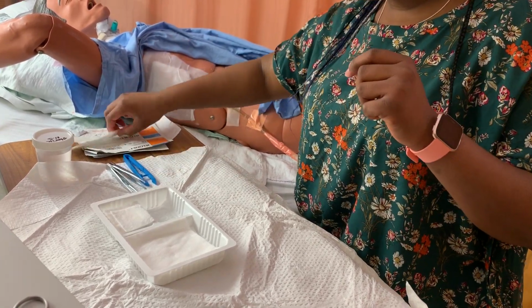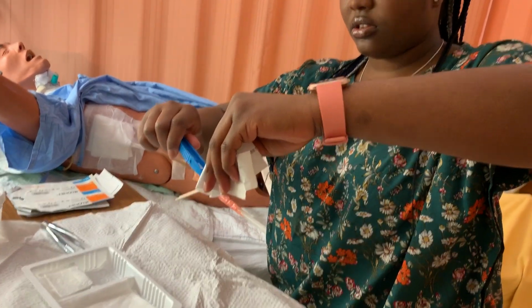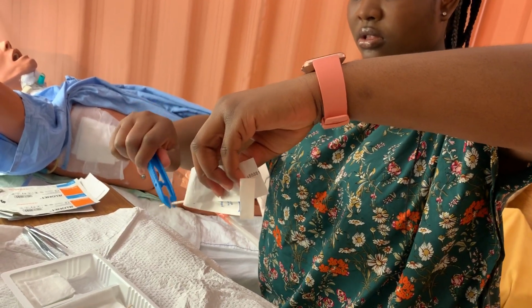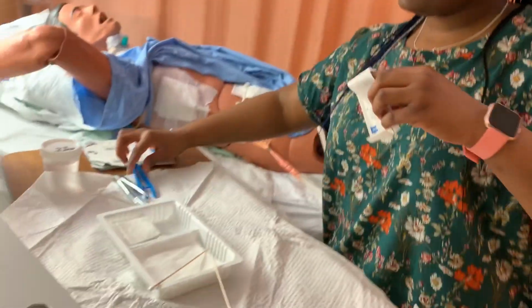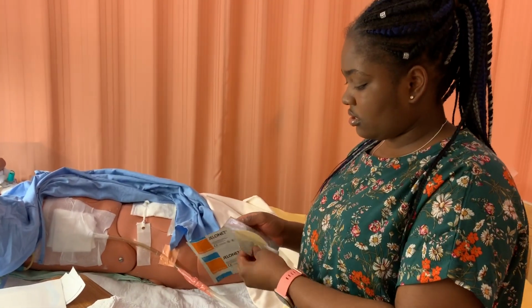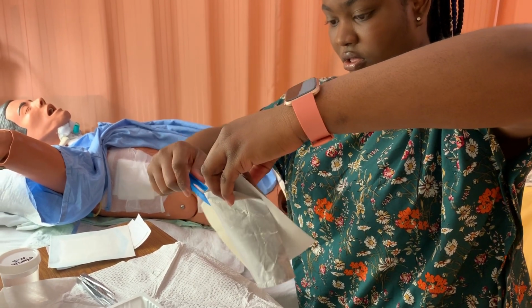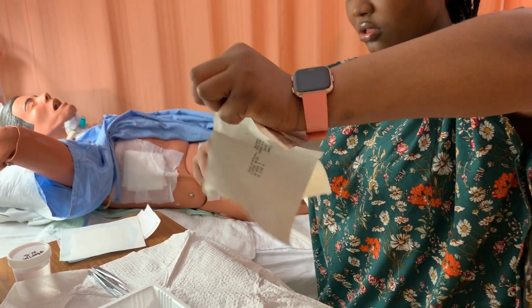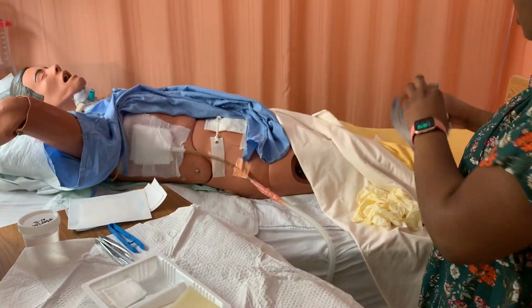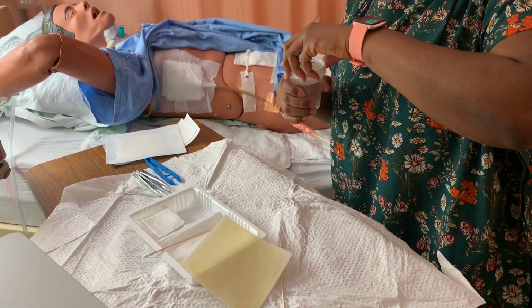Okay, I'm going to put this here. I'm just going to get extra cloth tape, just in case I'm going to need it. I know it's still bubbling. I'm going to get my gel on it. Now I'm going to get the pressure point.